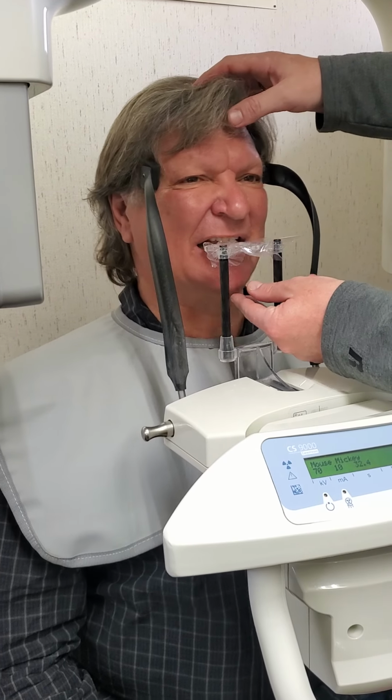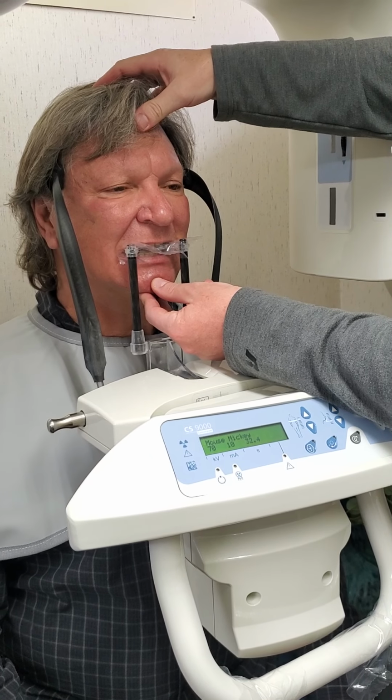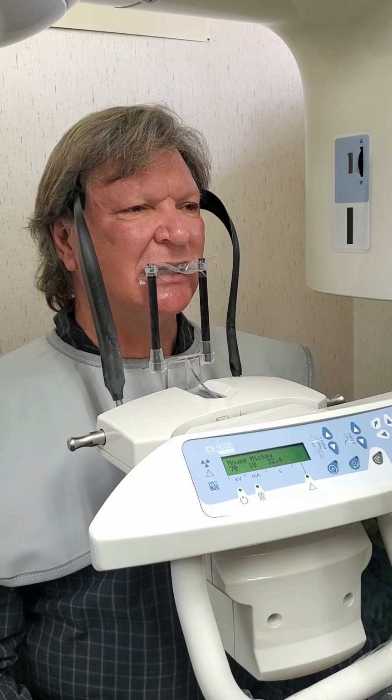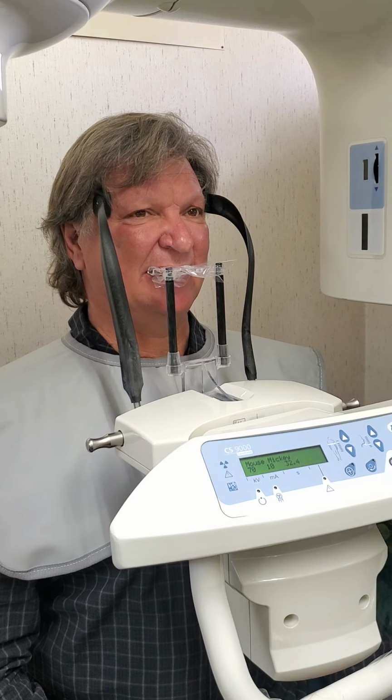Okay. And so that's, but just that way. See that little forward bit? Yeah. That way, when you position your patient and have them close down, you can scoot them all the way back to that ridge that's behind their anteriors. Now I feel it on my front teeth too.